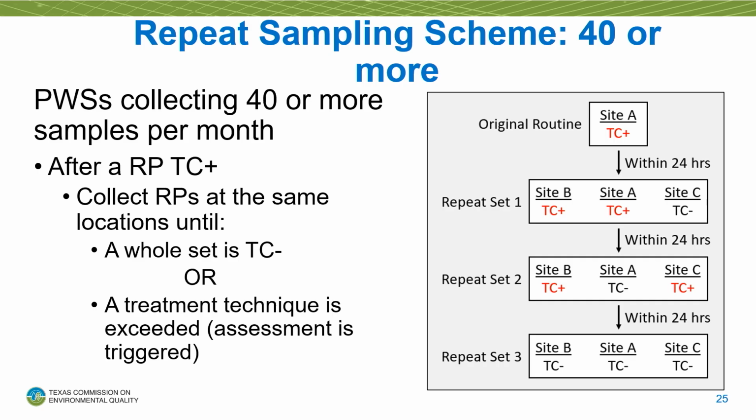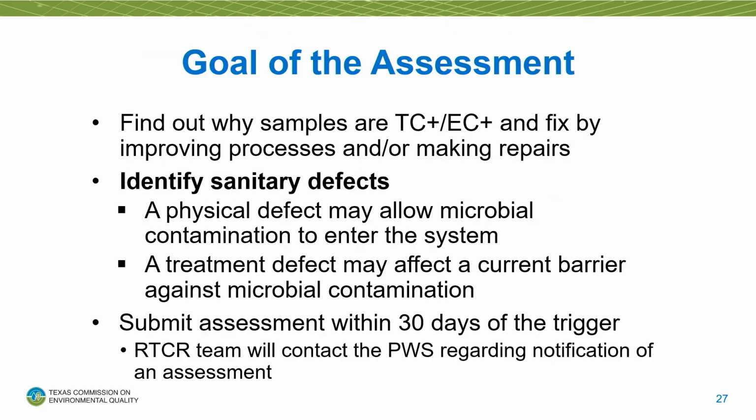So now I'm going to pass it off to Kristen, and she'll discuss the assessment process. So as Sarah mentioned, positive routine and repeat samples may be followed up by a level 1 or a level 2 assessment.